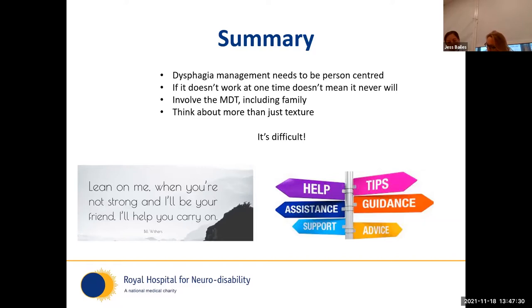Any experiences using Phagenyx for dysphagia treatment? So, the pharyngeal stimulation. No, in short. Go on, Amy, I'm one of the leads here. I'd be really interested to know if anybody is using it, because I recently tried to find out a bit more about it, and it's quite expensive, I think. You have to get it in on a patient-by-patient basis at a cost of a couple of thousand pounds per patient. And I think the evidence is still coming through. So if anyone is using it and wants to let us know, we would love to know, particularly for some of our more cognitively impaired patients, if it's something they can do a little bit more passively, we would be really interested in exploring and trying.